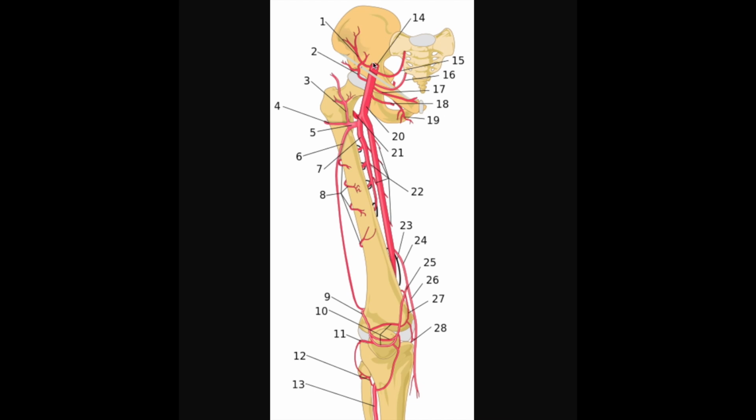So one of the first treatments to do from an interventional radiology standpoint, or an endovascular minimally invasive approach, is to go in typically from the contralateral groin, and you engage this artery here, and you're able to perform a diagnostic angiogram, confirm that this is an artery that's bleeding, and you can treat with different agents such as particles or gel foam, and that treatment should help this bleeding stop.